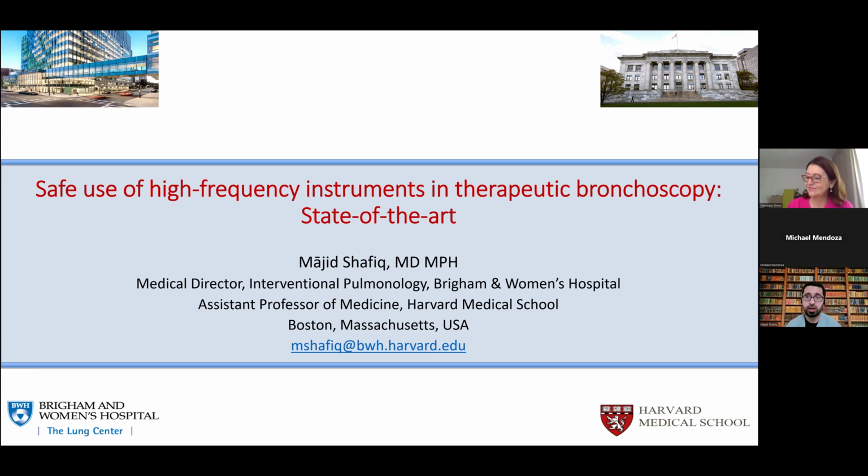I don't use stenting ever for asymptomatic patients and prophylactically. In fact, I tend to be very conservative with stents. So, the best stent is a stent never placed. I am always looking to prevent my patient from getting a stent, which is really a new disease.